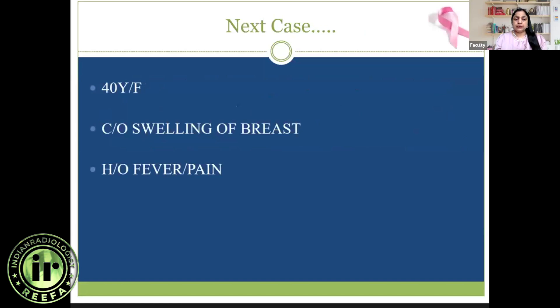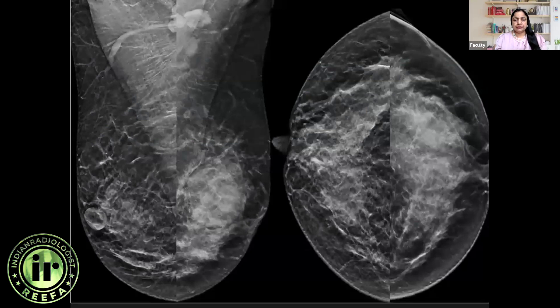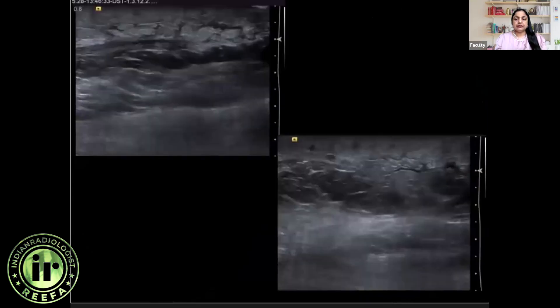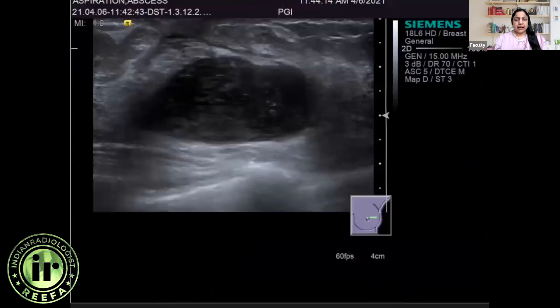A 40-year-old female presented with breast swelling, pain, and fever. Mammogram showed an equal-density obscured mass in the upper outer quadrant of the left breast with a few ipsilateral enlarged lymph nodes. Ultrasound revealed skin and subcutaneous thickening, edema, and fluid in the tissue planes. Targeted ultrasound at the site of the mass revealed a fluid collection with internal echoes.